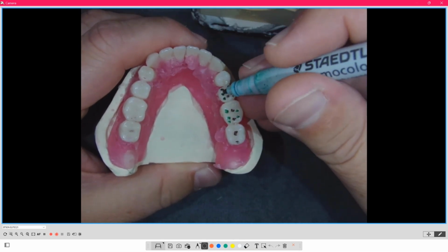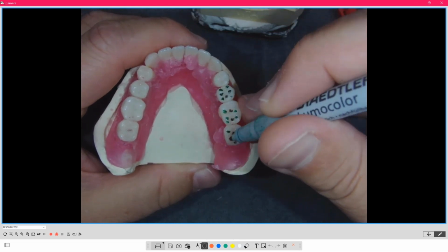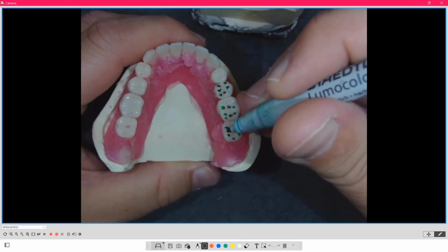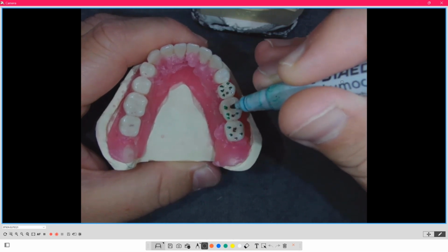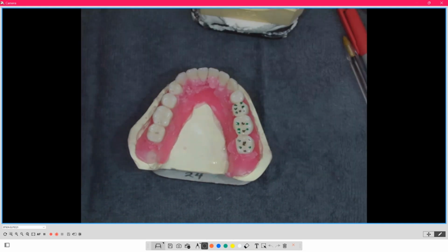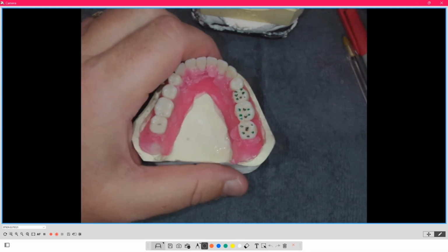And so if I make any corrections to someone's occlusion, it's typically me adjusting in these areas that I'm marking in green, to just allow for those red cusps to come in more unencumbered and land on that black dot, okay? The other big thing that I'll bring up now that you've heard me, and for those of you that know me, preach, is we also have the freedom in centric concept.